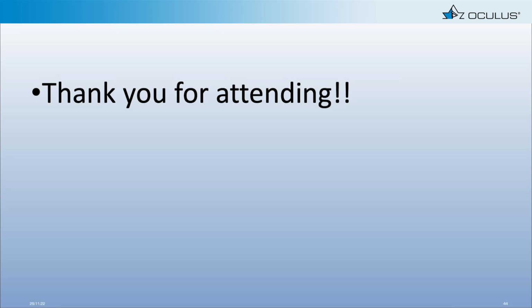It's not very easy to create a lens that touches down over the entire scleral alignment zone of the lens 360 degrees. And there's no eyeball out there that's got 500 microns of toricity in just the sclera. In those patients where you look at your ring diameter and see a scleral toricity of 500 microns, I guarantee you half of that at least is coming from the cornea and limbus.